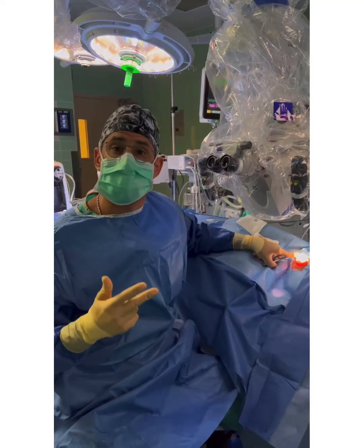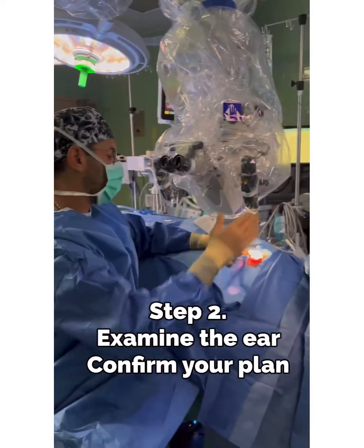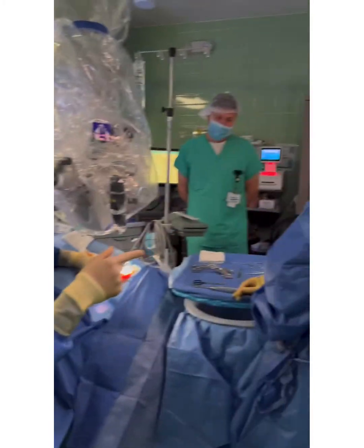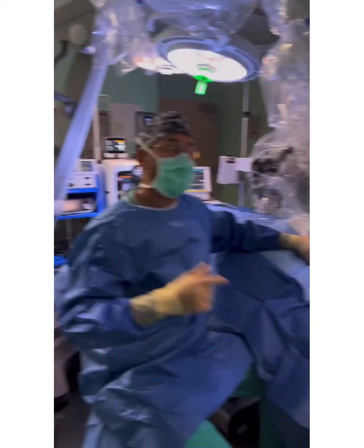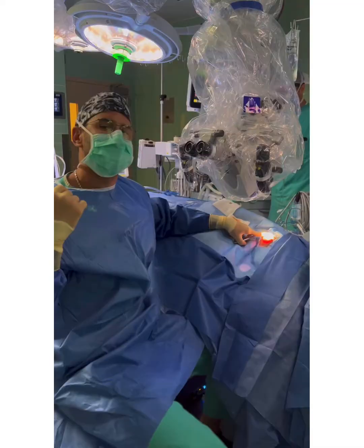All right, so you saw the room set up and now we're proceeding with surgery. I've got the microscope here and the patient draped in a sterile fashion. We got Julia, we got Dr. Jonas Ziskwit, anesthesiologist extraordinaire, great tennis player and basketball player. We got Carlos over here and we want to show you the perforation that this patient has, which we're going to fix. So take a look on the screen.